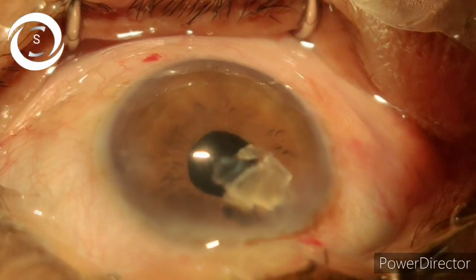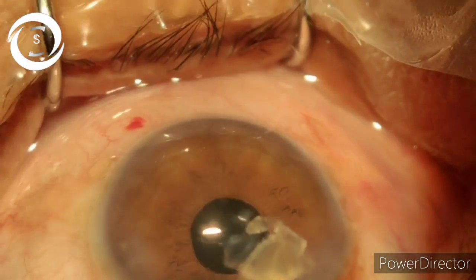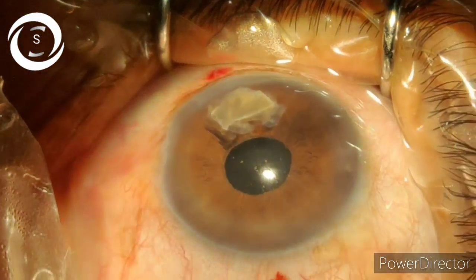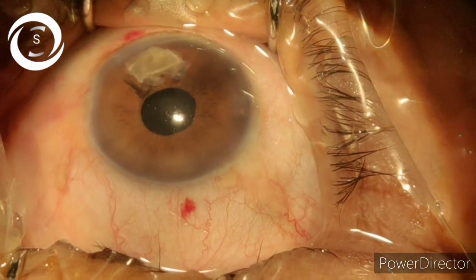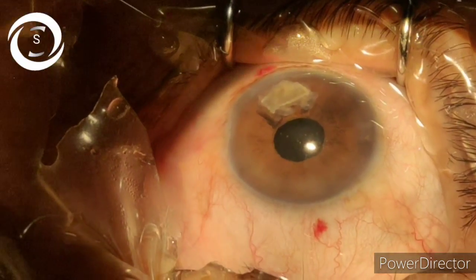Heather described the importance of a 360-degree sweep under the iris when you are concluding your phaco surgery, because sometimes a large chunk of nucleus or cortical sheet is present deep in the ciliary sulcus behind the iris, and you think you have removed everything.